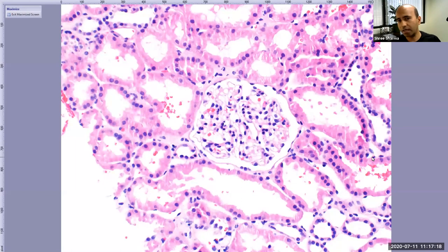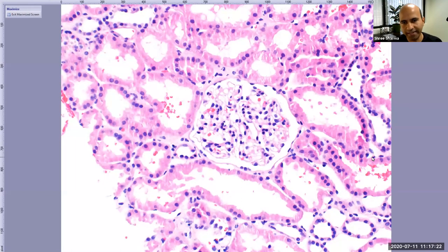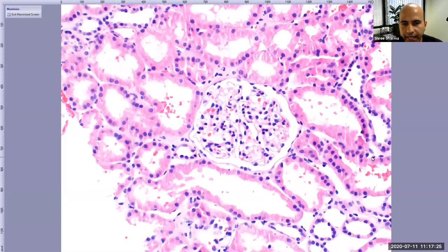When you see tubules that don't have much cytoplasm and have a flattened kind of look, that is a distal tubule. The areas in between the tubules is known as the interstitium. There are a lot of new words coming in — as we move to different stains, I will go over those names again.